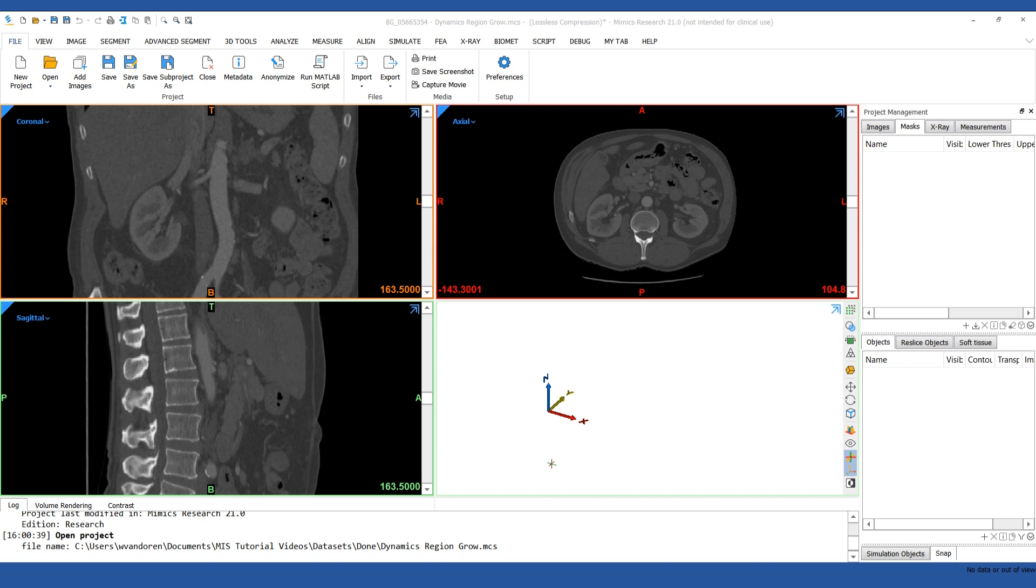In this video we're going to explain the dynamic region growing tool. This is a tool that combines thresholding and region growing in one step. It's based on the connectivity of gray values within the specified range of seed points of your choosing.